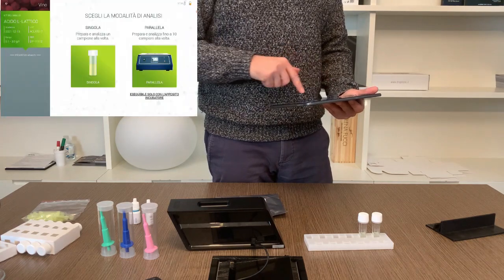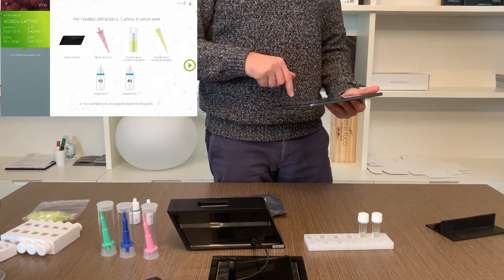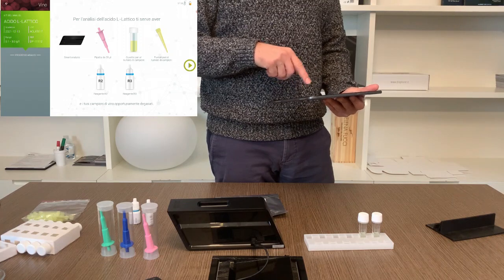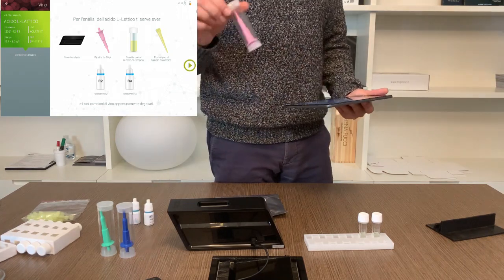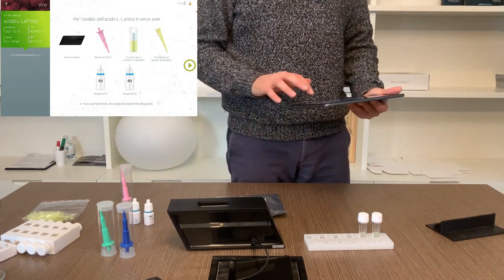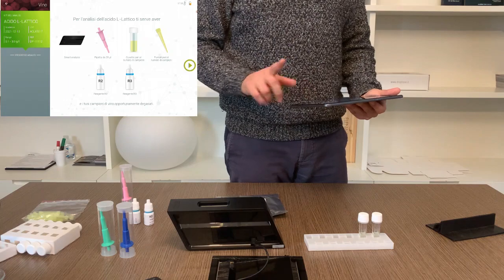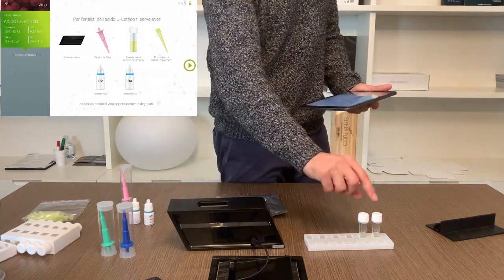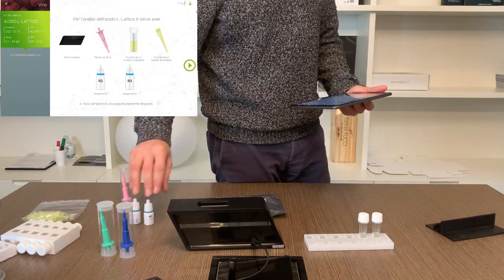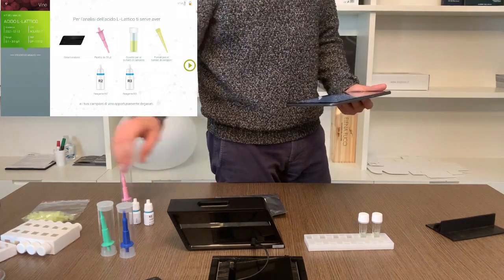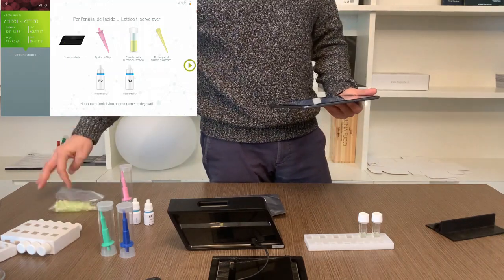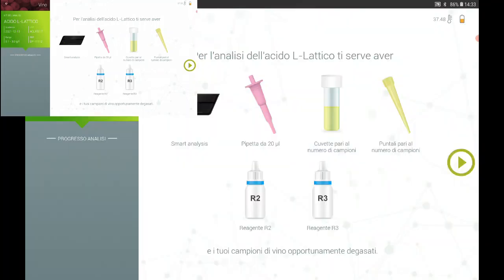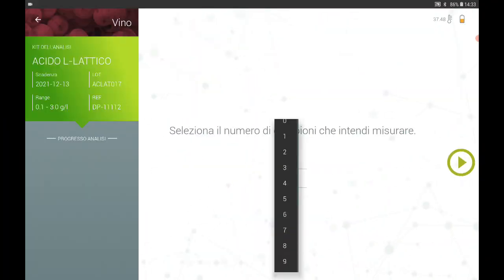At this point the app shows you all the material you need to carry out the analysis, which you can prepare on your workbench so that you have everything you need when you start with the manual operation. Continue, set the number of samples you want to analyze for this parameter and give a specific name to each of them.